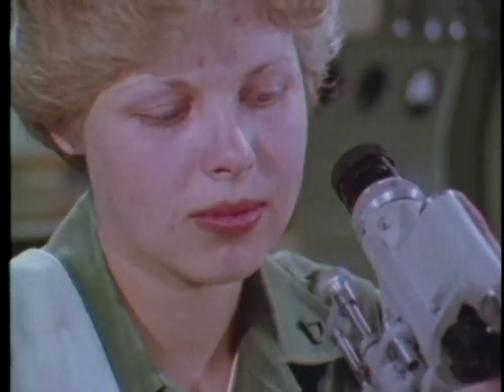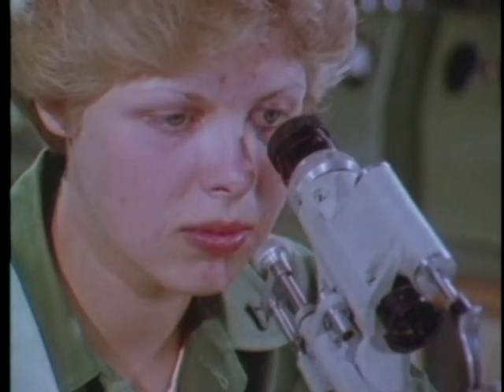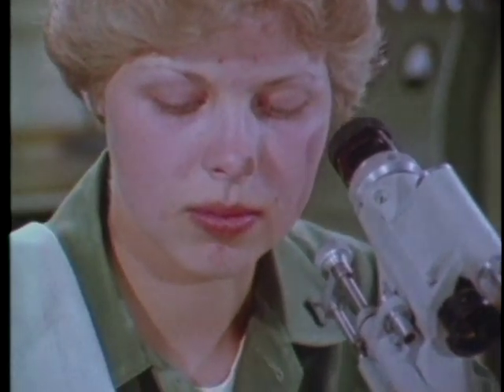Now you're ready to take a reading of the lens power. Always keep both eyes open when using the instrument, otherwise you may get severe eye strain.